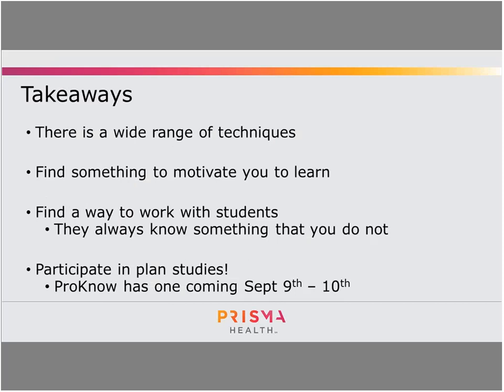So here are some takeaways, or hopefully the takeaways that some of y'all got from this talk: there is a wide range of treatment techniques. By no means am I saying that these are great standalone and you must do these from now on, but there are a lot of different ways to do it. I think one thing is to really question yourself and make sure what you're doing makes sense to you. Then find some way to motivate yourself to learn, to make sure that you're constantly improving. At least for me, I found working with students is a great way to do this.